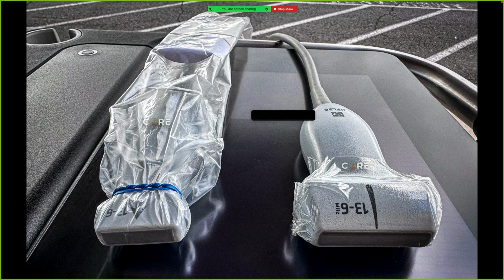Really what I'm doing with the Tegaderm is adding a slight increase in protection to the patient, but it helps me with cleanup because there's often a little bit of blood on there and there's gel, and if I just do it with the Tegaderm, then take the Tegaderm off, the probe is clean. I'll still clean it afterwards.